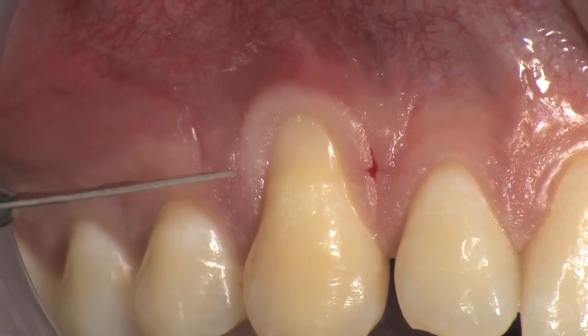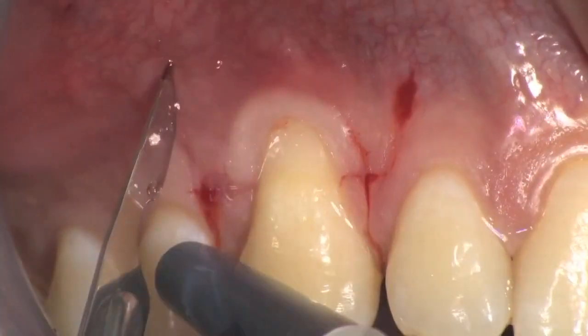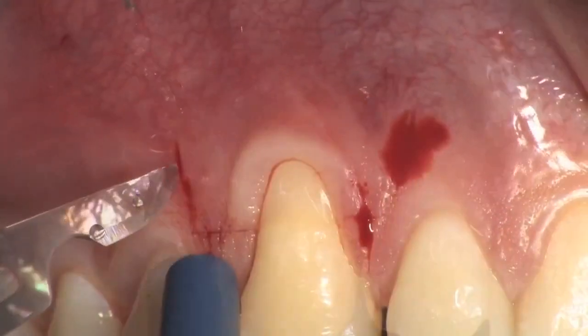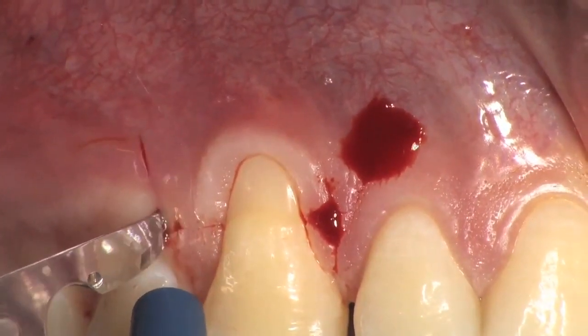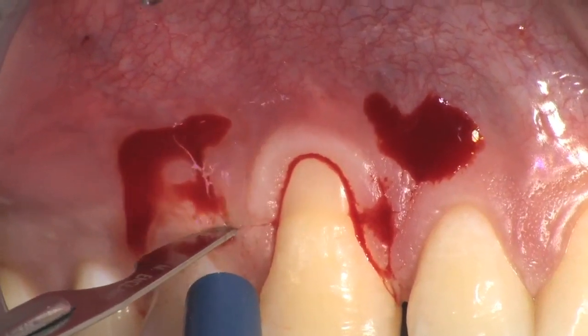After anesthesia, horizontal incisions are made mesially and distally to the affected tooth at a distance from the tip of the papilla equal to the recession depth plus 1 mm. Two vertical releasing incisions are then extended to the alveolar mucosa. These incisions must be as short as possible to avoid scar formation.